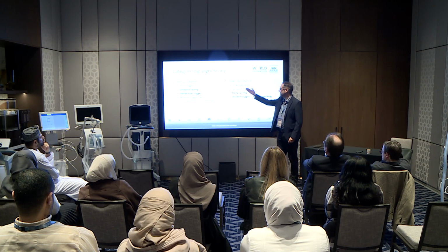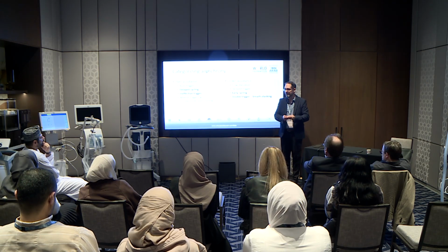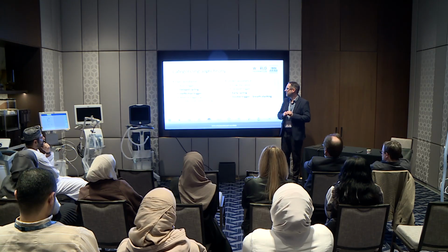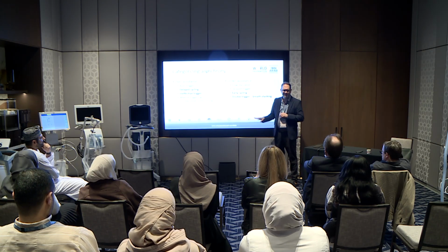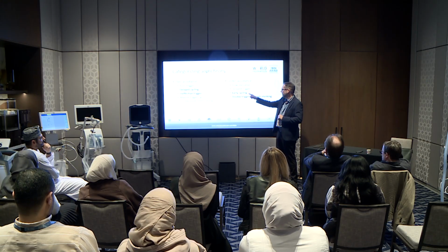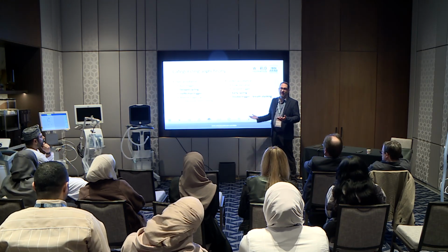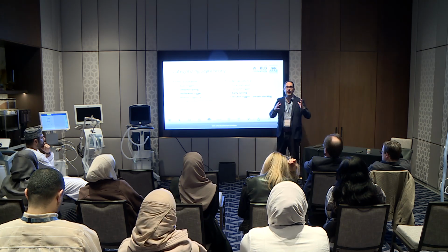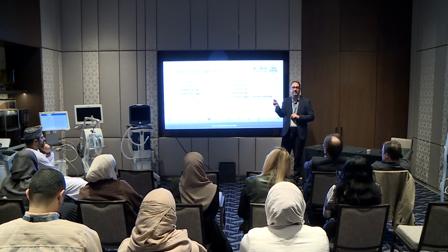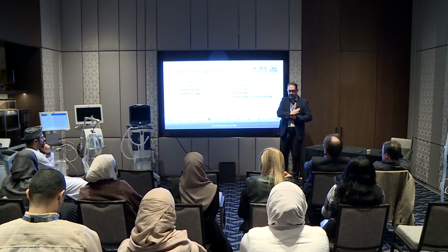And then under assistance, flow starvation, I think we'll be able to identify that in volume control very easily. Pressure control is a little bit trickier. Delayed trigger, I won't quiz you on that one, just so you know. Early cycling, again, the ventilator cycles off. Under assistance, based on time, it's cycling off too early, it's not supporting them the amount of time that they want, so it's under assistance from a timing standpoint. They might be getting enough support, but not long enough, okay?